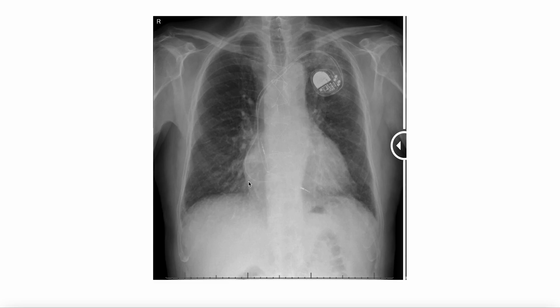In some cases there is biventricular pacing, in which case there is a third lead that goes through the coronary sinus to the epicardial side of the left ventricle. That can give left ventricular pacing, which is useful in patients with bundle branch blocks with very wide QRS complexes, where the ventricular dyssynchrony can cause hemodynamic disadvantage.